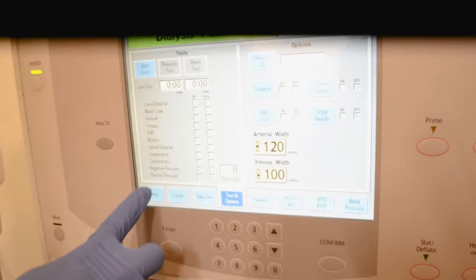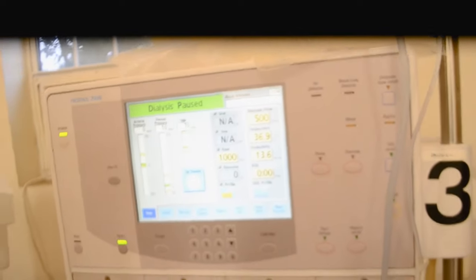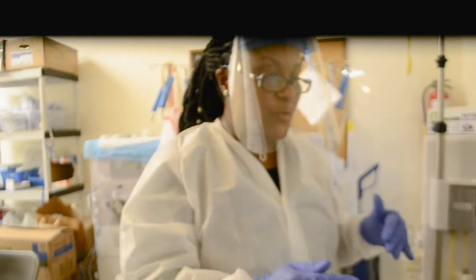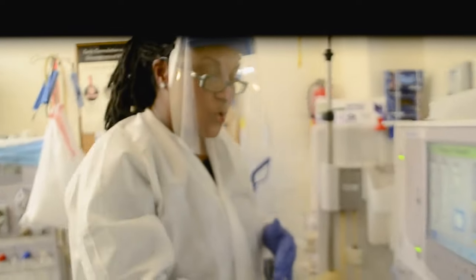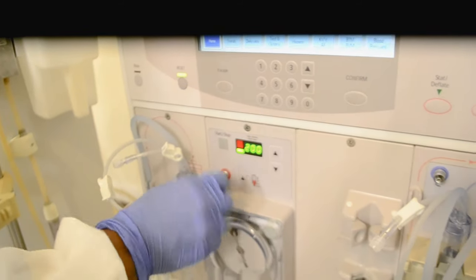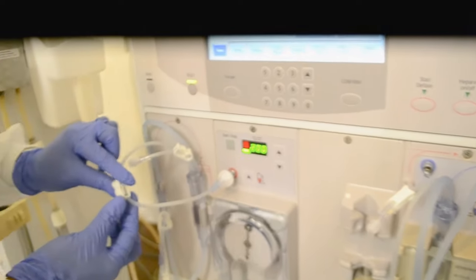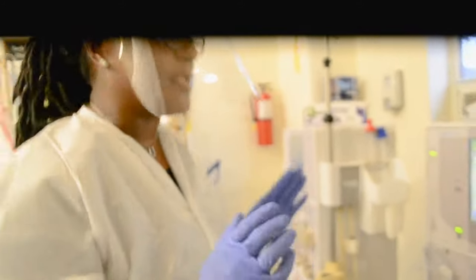I'm going to escape and go back to my home screen. When your machine is finished and the test says test complete, you're going to do the last thing you did before pressing the test and option button, which was to remove your transducer filter protectors. So that's the first thing I'm going to do when I'm finished testing — put them back onto the machine. I'm gently tightening them.